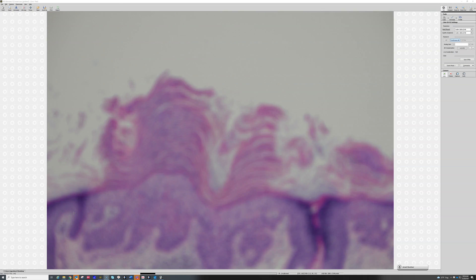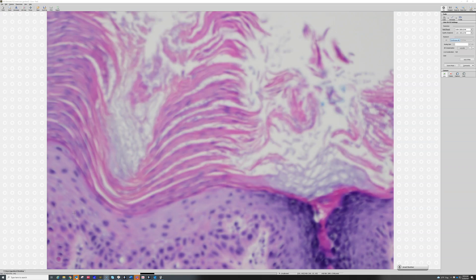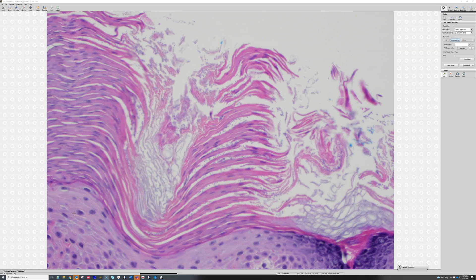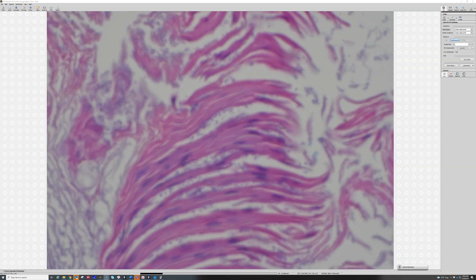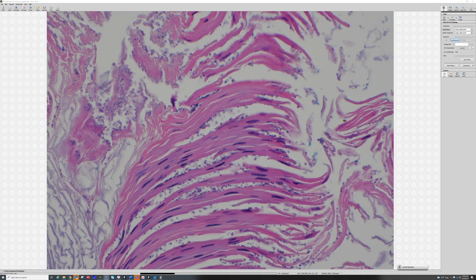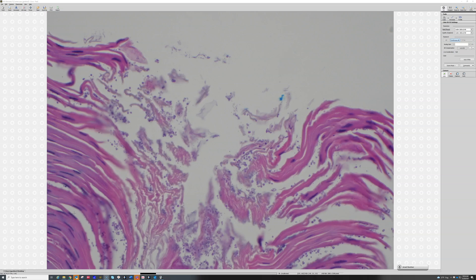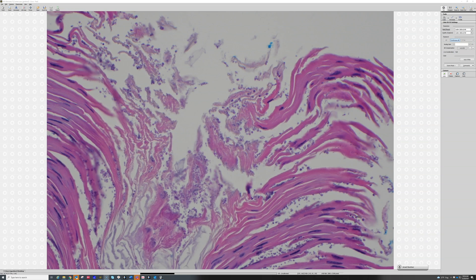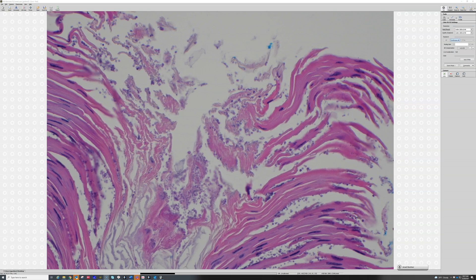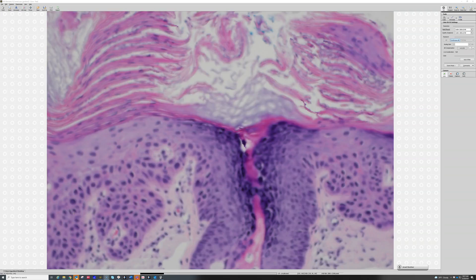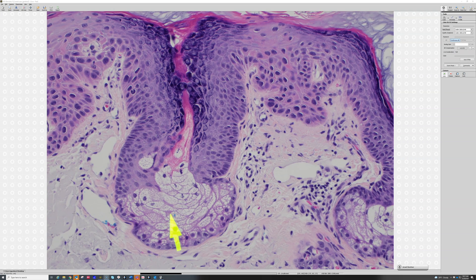One final bit of information from this case: any time you've got a real thick corneal layer, whether ortho or para, you have a tendency to get some organisms that come to hang out and grow. These round structures you're seeing here are yeast, and they're not causing any problem. They're just commensal organisms hanging out and eating the oils — the sebaceous secretions of your skin that drain to the surface. These are Malassezia, also known in the past as Pityrosporum fungus. They're a type of yeast that lives on basically everyone's skin, usually in the openings of hair follicles because they live off sebaceous secretions. Here's a sebaceous gland — they're bubbly because they're full of fat.